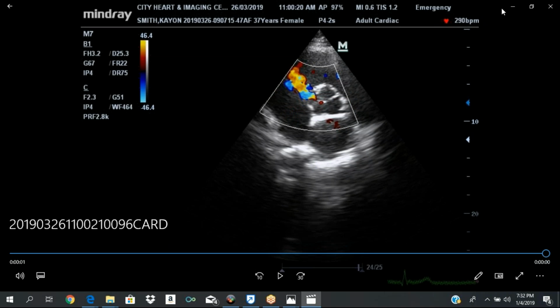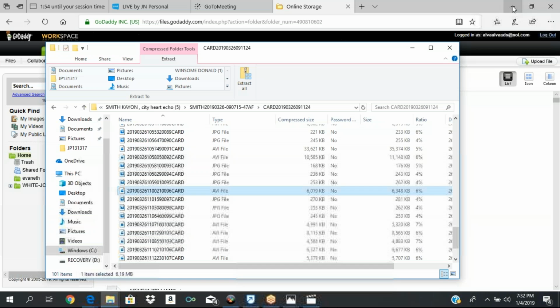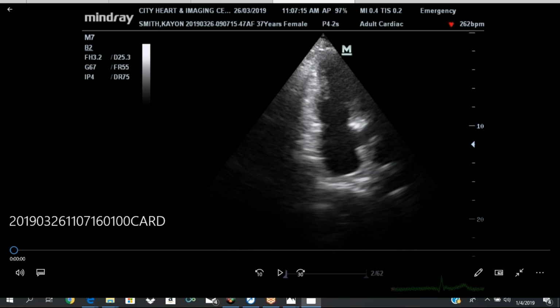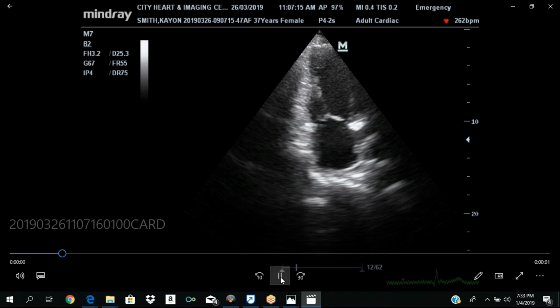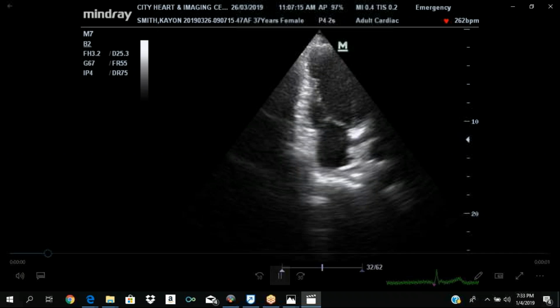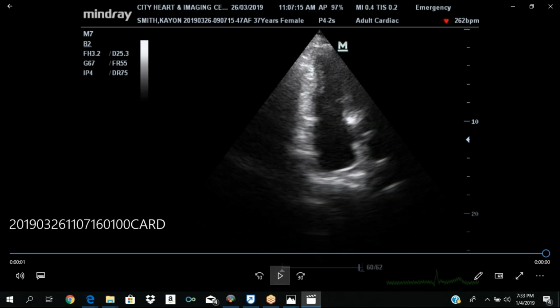She was just looking at the VSD, but we're not going there. So this is your 2-chamber view. You're going to rotate the transducer counterclockwise, and this is going to be your inferior wall right there. This is the anterior wall, the mitral valve inside. This is your left atrium. Your apical 2-chamber view.